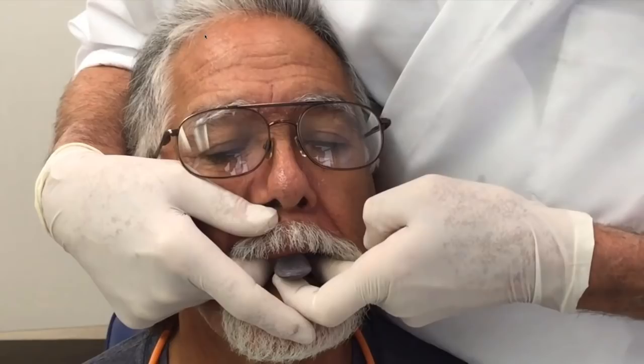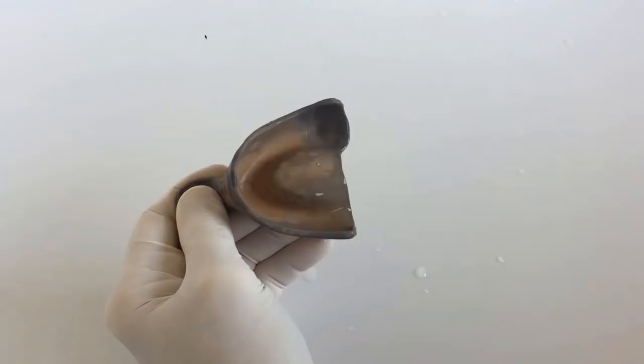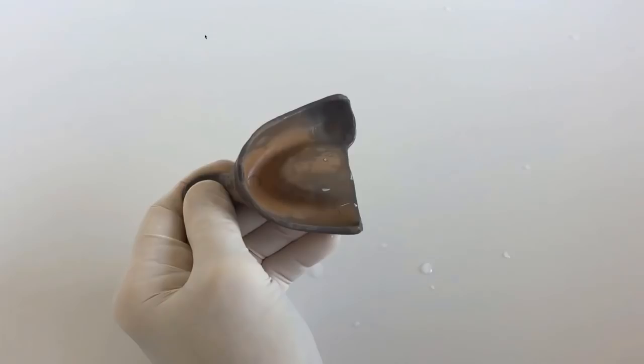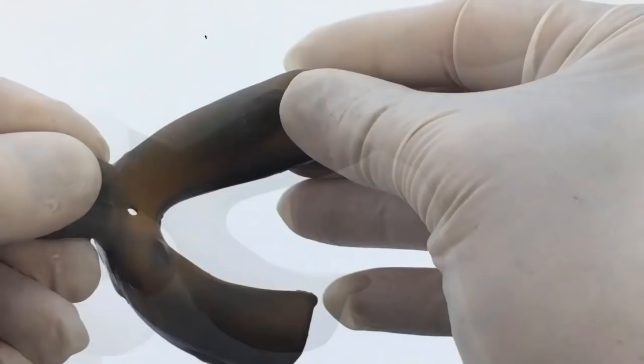One thing with this tray is you can actually stretch it if you need to. One common place you miss a maxillary final impression is over the tuberosities, often because trays are too short. With this warm tray, you can just stretch it, which makes it much easier to adapt in the mouth. You can do the same on the lower — the big mistake for lower impressions is not getting over the pear-shaped pad, so with this tray you just stretch it, pull it a little longer so it goes over there if you need it.